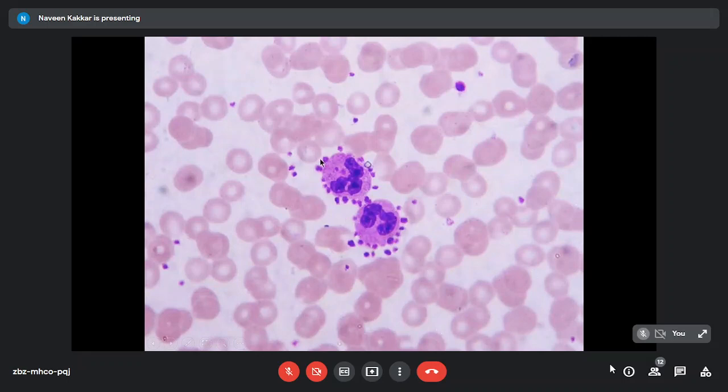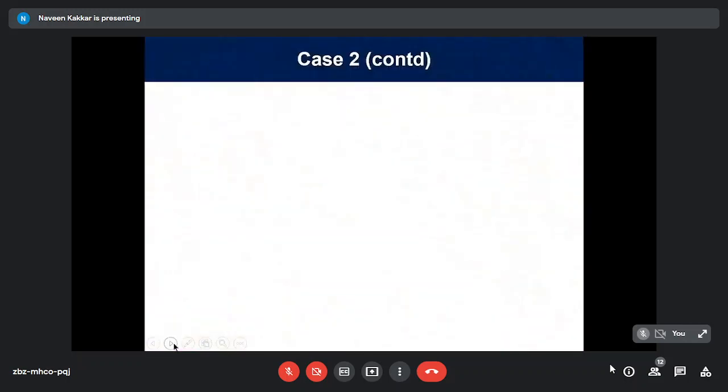That's platelet satellitism. There's an antigen-antibody receptor binding. This happens only in the presence of EDTA. EDTA causes the epitope sites on the surface of the neutrophils to open up, and the platelets come and bind with the receptors. So as the stream is passing through the channel or the aperture, the platelets are not counted; in fact, they are getting stuck to the WBCs and going as WBCs. So they are being undercounted because they are not there in the rest of the sample. Remember, this is not happening in the patient. This is an in vitro phenomenon. It's happening in the tube once the sample is taken. So there's nothing to worry about in the patient.